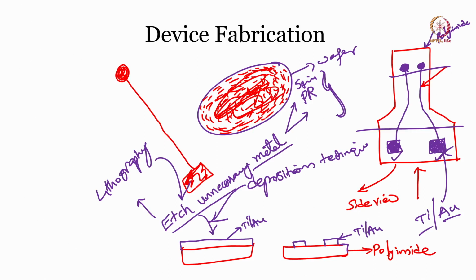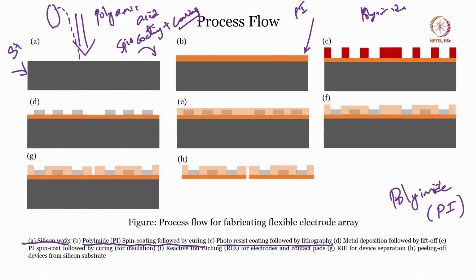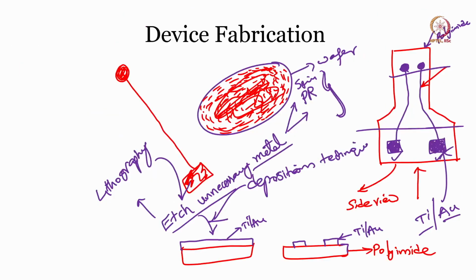So, what you do is, this is a photoresist. The photoresist has been spin coated and you perform something called lithography. Assume that you know the steps of how to create lithography. Lithography is nothing but the process of transferring the pattern, that is it. You want to create this pattern, this kind of pattern. Let me take the pointer. You wanted to create this kind of pattern.